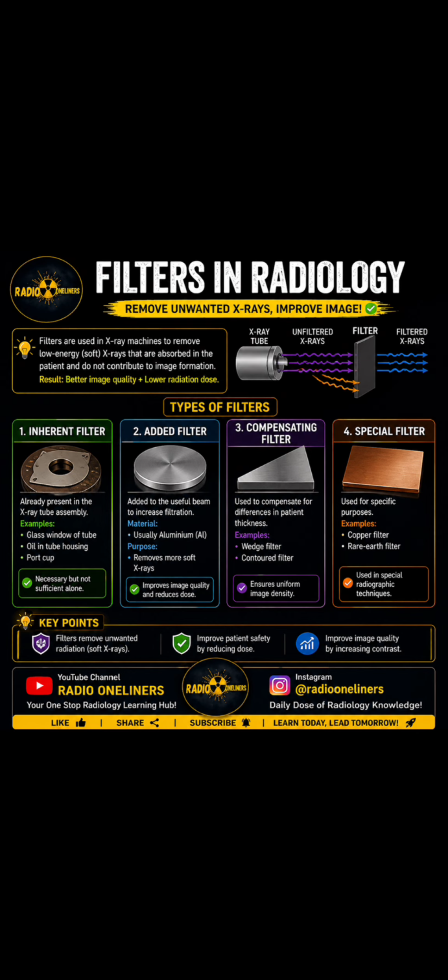So, here we are with our next topic, which is filters. Means filters in radiology, okay?